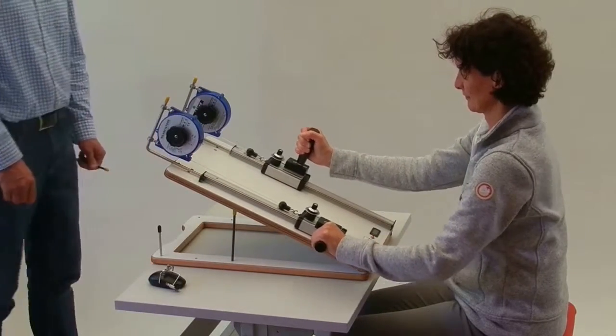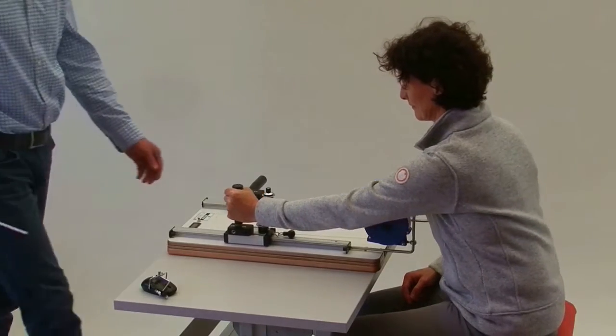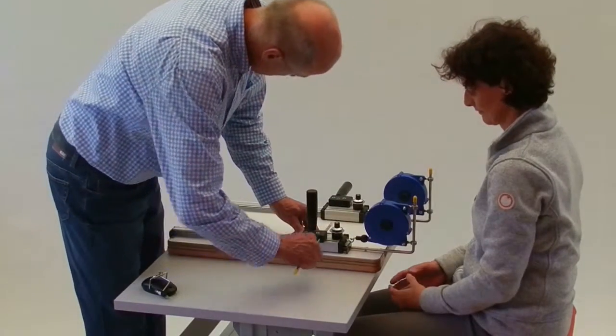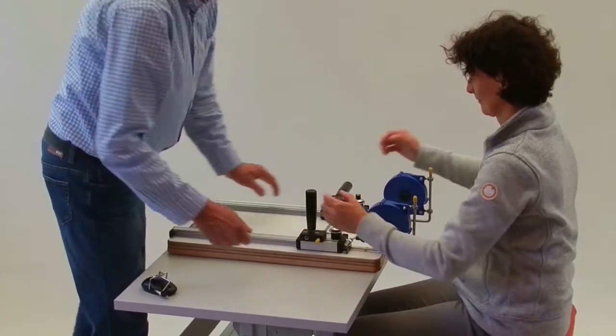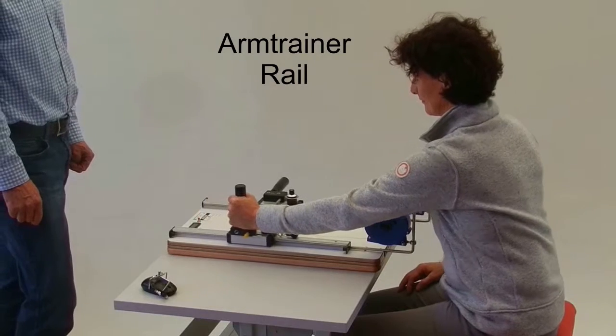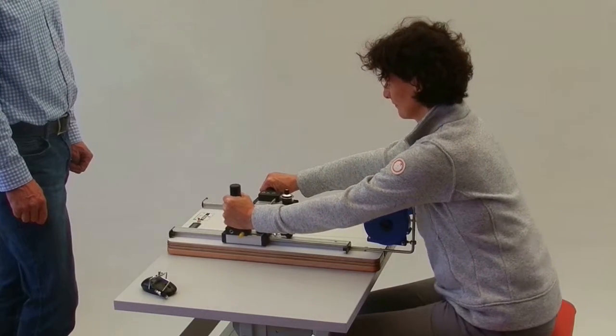When comparing the setting and application possibilities of Arm Trainer Rail with those of Arm Trainer Multi, many parallels can be seen. In contrast to Multi, the rail has no tilt functions. When planning an arm laboratory, the following should be considered: not as flexible as possible, but as flexible as necessary, to avoid too much adjustment work.